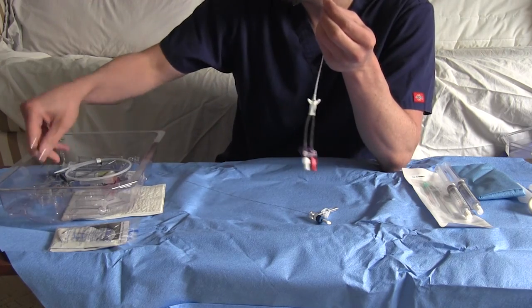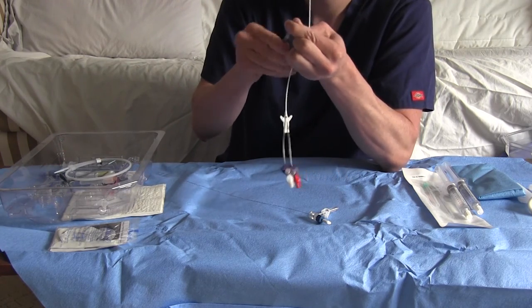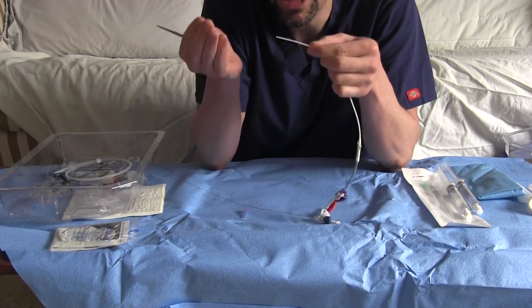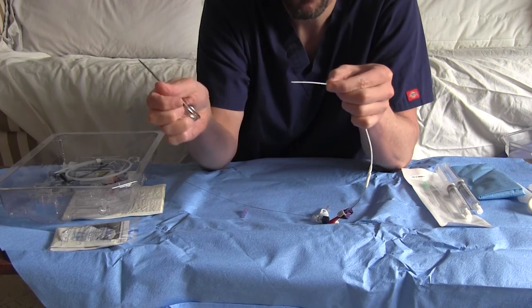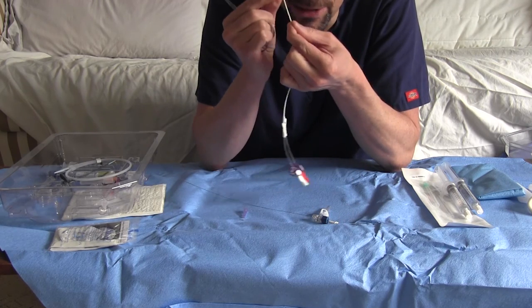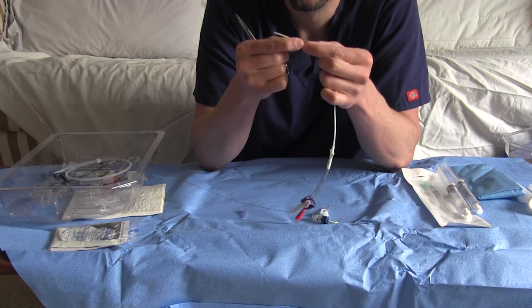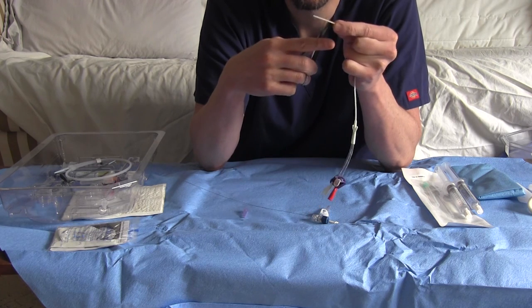And I'm going to take the scissors that are in the kit and cut it at 17. And now I know the wire is not there. You cannot cut the wire. So the markings on the side, it goes 20, 19, 18, 17. So I'm going to cut right at 17. You just cut it straight across.